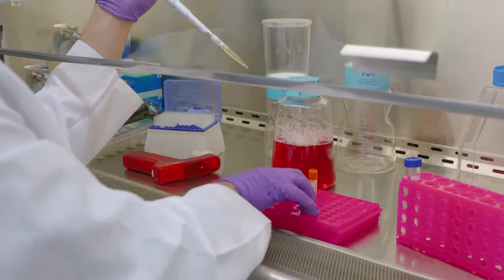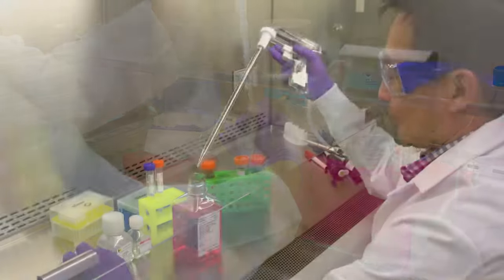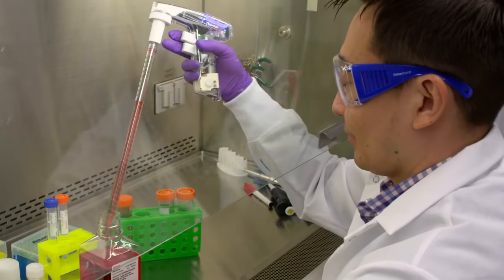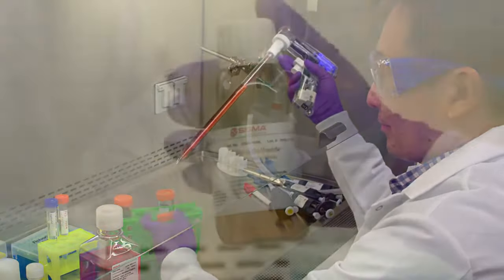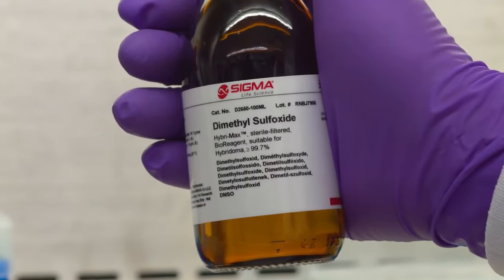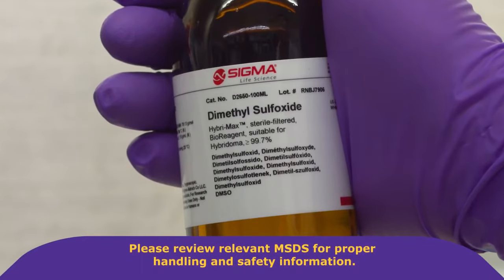So how do we safely bring them out of their frozen state with high efficiency? For starters, always wear proper protective equipment to protect yourself from risks associated with mammalian cell culture and handling liquid nitrogen specifically. Cells are stored in freezing media containing dimethyl sulfoxide, commonly known as DMSO, a cryoprotectant compound that readily diffuses through the skin. Please review the relevant MSDS for proper handling and safety information.